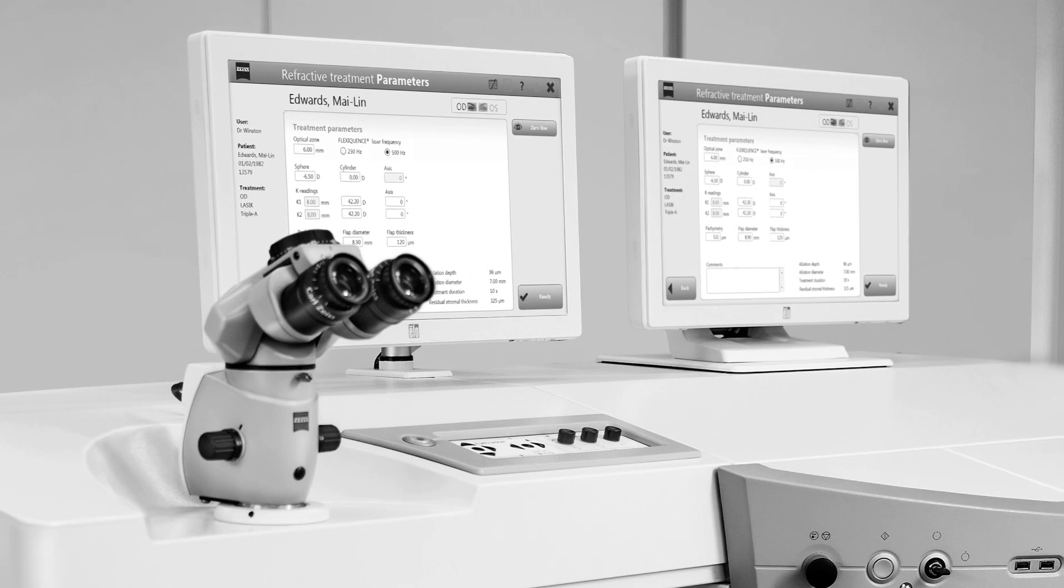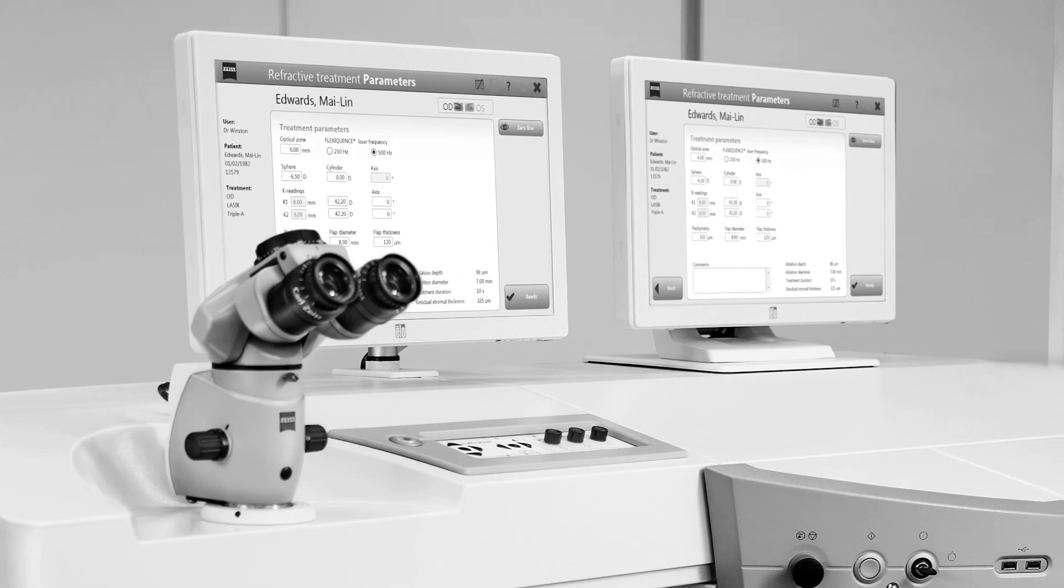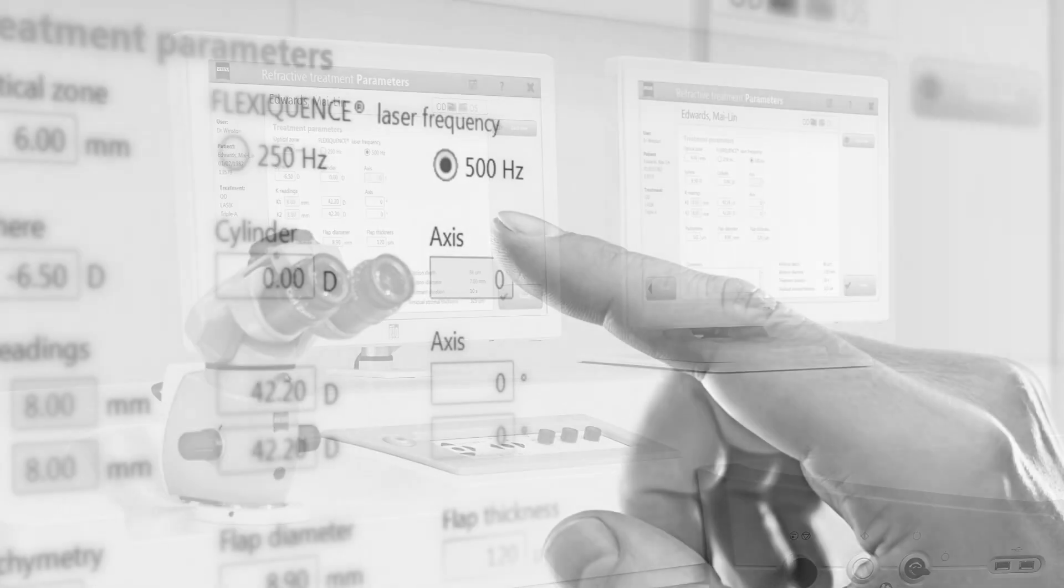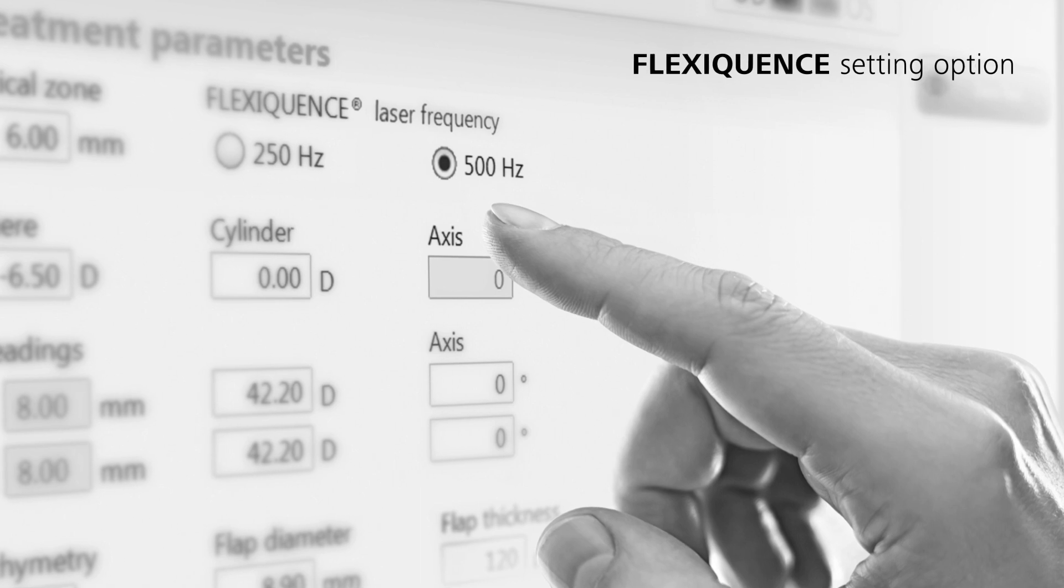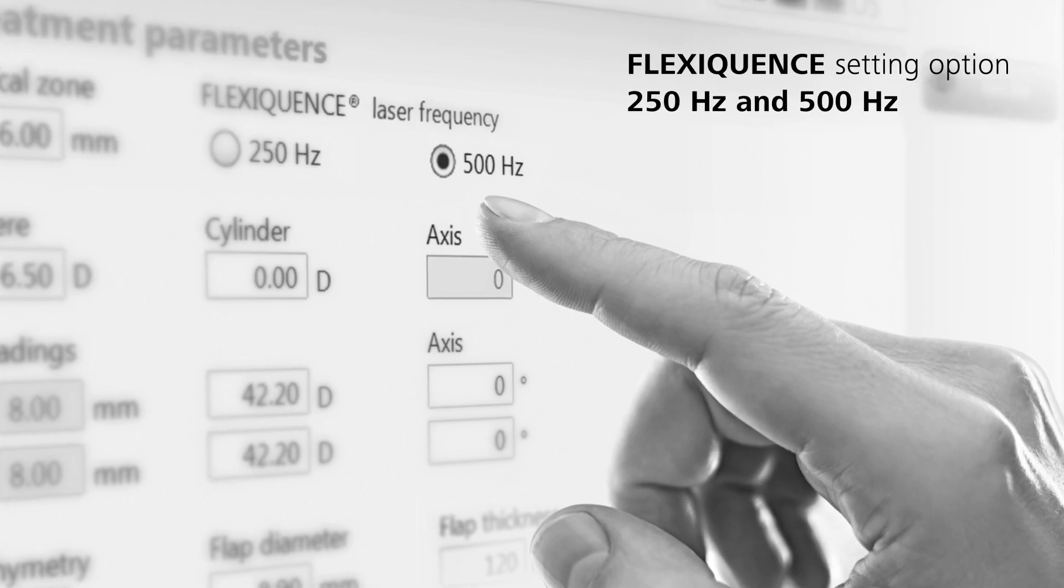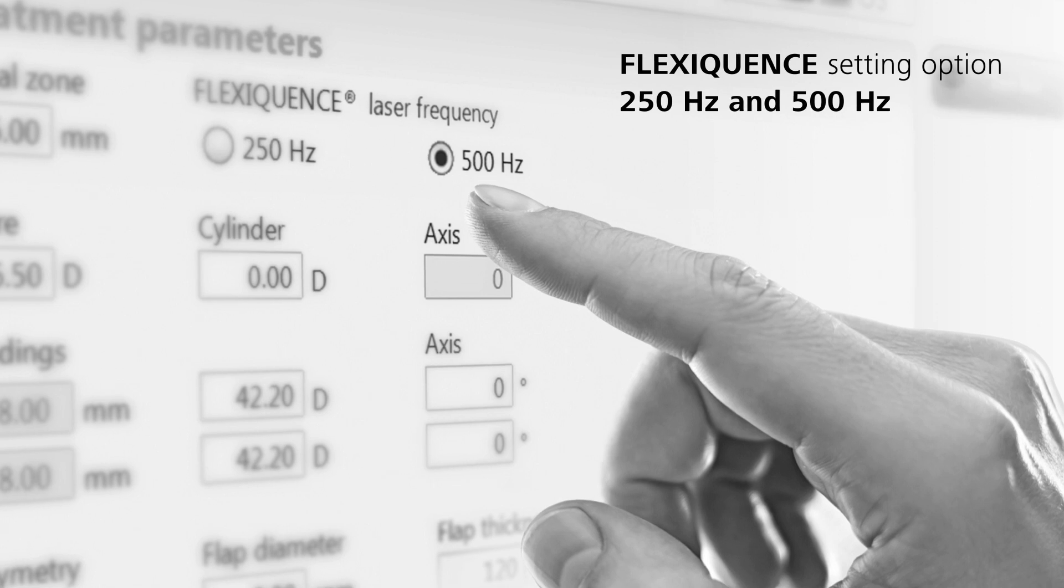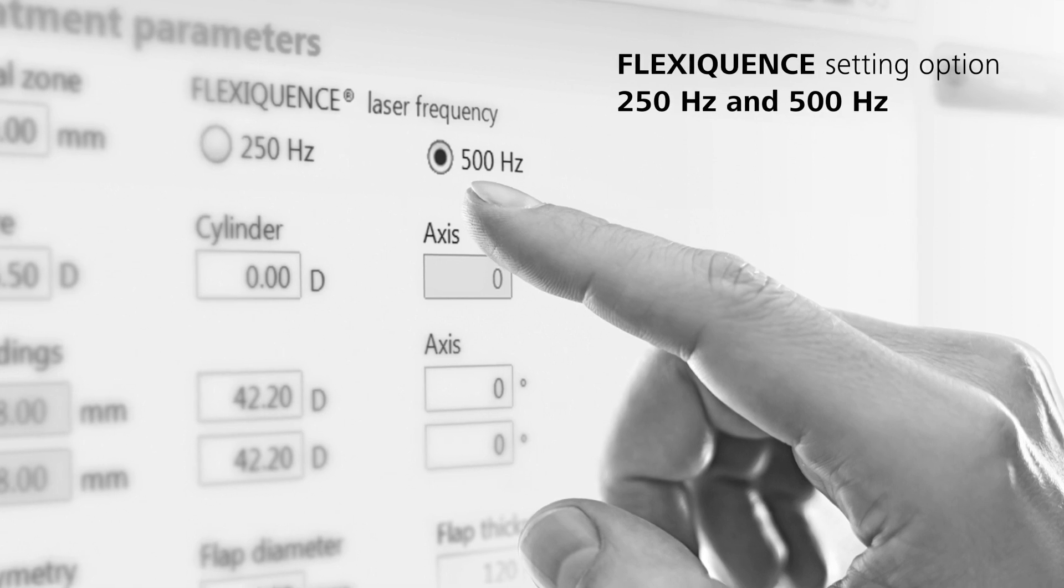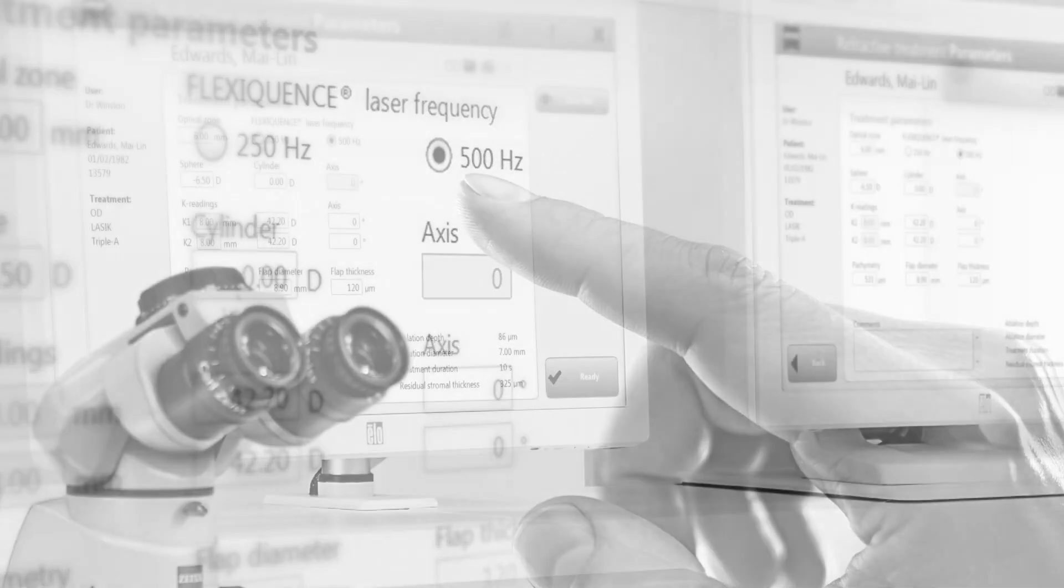You'll love how the MEL 90 adapts itself to your work style. FlexiQuence setting option: 250 Hertz and 500 Hertz. Choose between proven operating experience and exciting new opportunities.